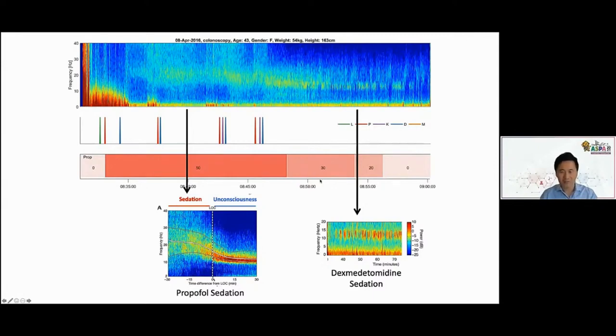The dexmedetomidine will reach some effective concentration, and you'll start to see the propofol pattern for sedation give way and transition over to the dexmedetomidine, with that one note, intermittently, sort of taking over as the patient emerges, and then providing some degree of sedation as she's emerging and not disrupting ventilation.